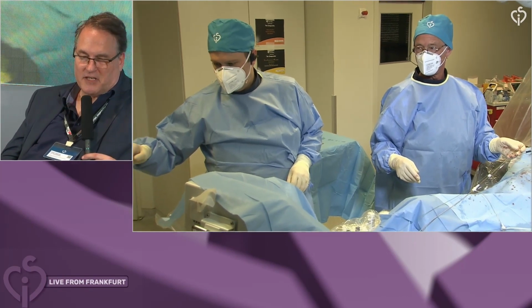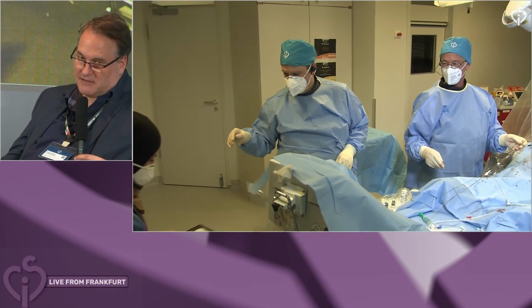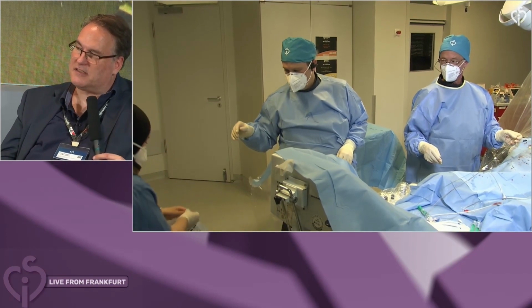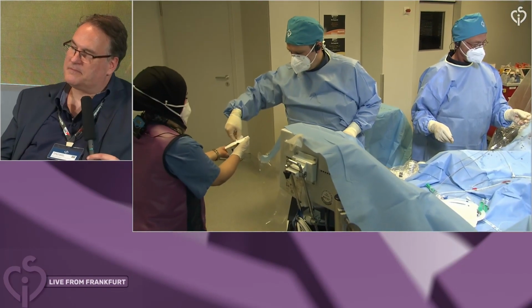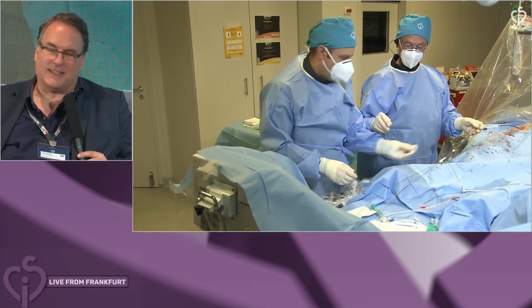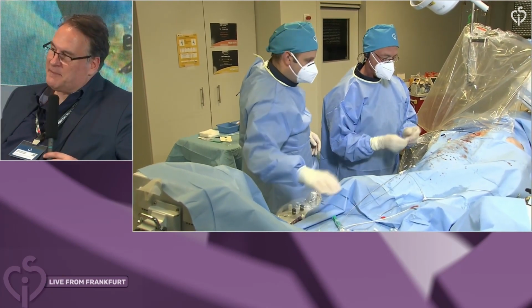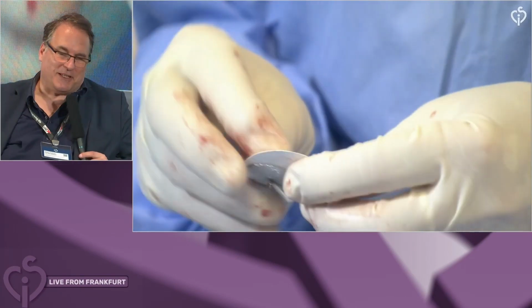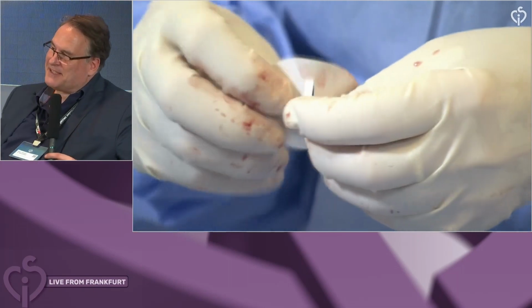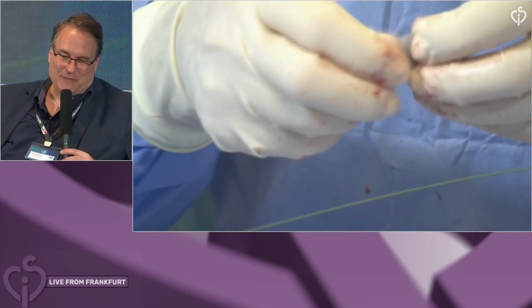I think the standard device, so 30, is just an alternative. As you saw in the first case, of course, ASD occluders are also there. So I would say that the majority is 25 for PFO. 99% is 25. Very good. The argument is just not to do anything, just put a 25, unless you have something exceptional anatomic. That's why Horst skips the echocardiography, you know. So here he was diluting his judgment a little bit, and he ended up doing the same that he would have done without all the additional information.